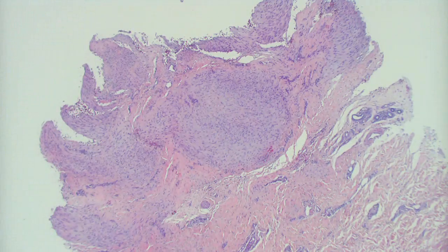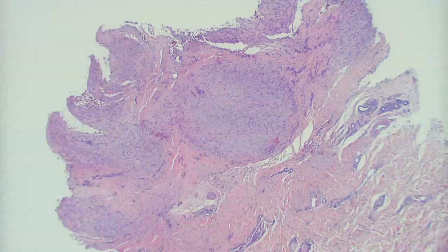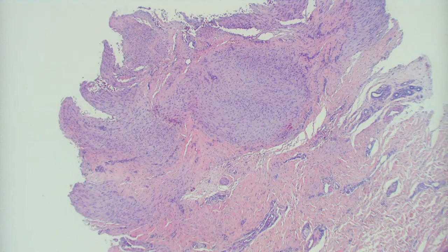So epithelial or non-epithelial? Non-epithelial. Good, non-epithelial. Usually when it's spindle, favors non-epithelial. That doesn't have to be. You can get spindle cell squamous cell carcinoma, for example. But still, in most cases, it's going to be non-epithelial.